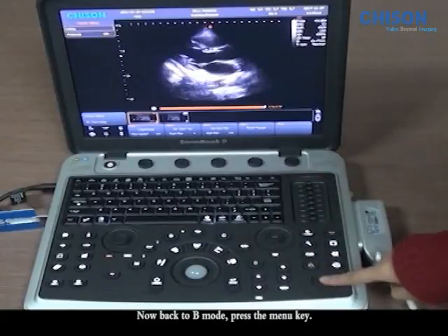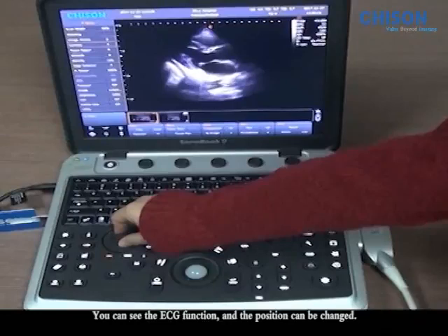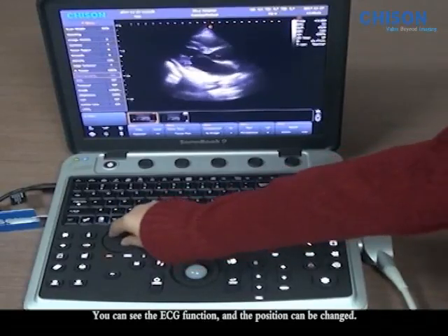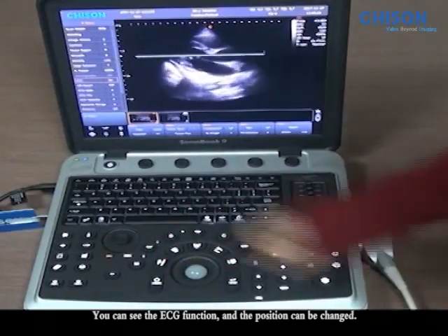Now back to B mode, press the menu key. You can see the ECG function and the positions can be changed.